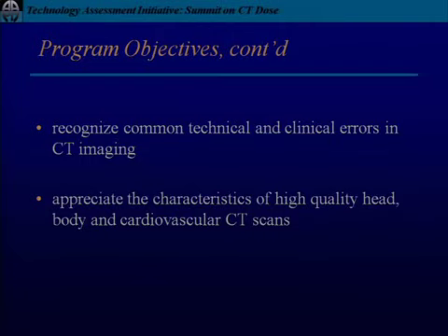At our practice, we are a level 1 trauma center. A good number of our exams are for trauma, and there you have to include the eyes in the field of view. Minor technical clarification.